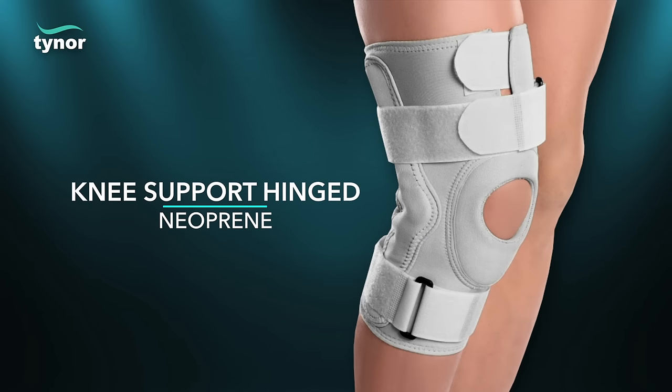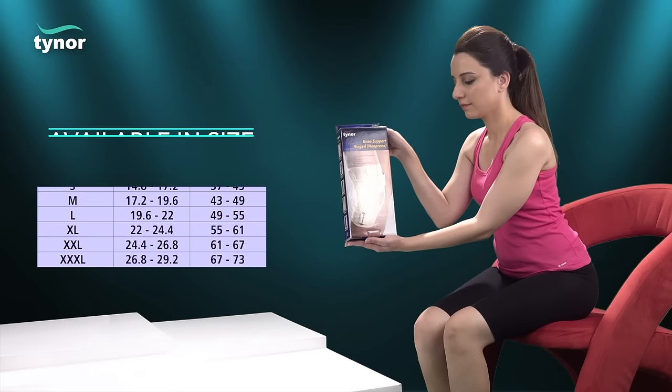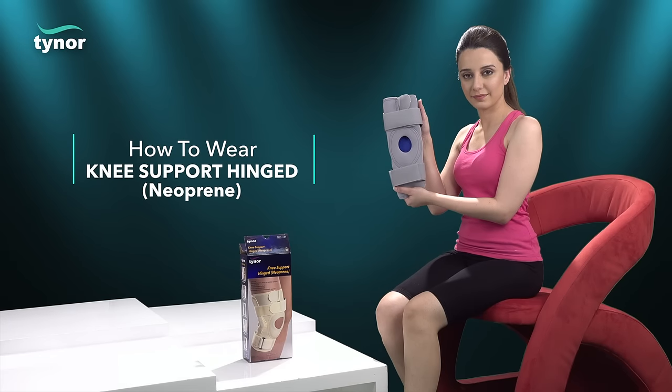Here we will discuss how to wear the knee support hinged neoprene. The knee support hinged neoprene is available in six sizes. Measure the circumference around mid-thigh, approximately six inches above the knee.